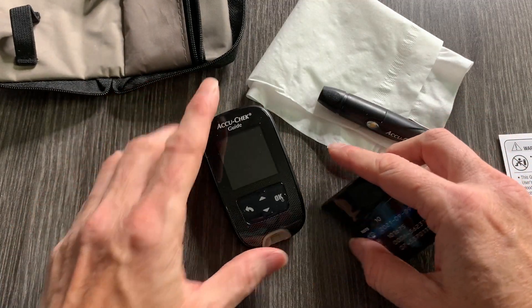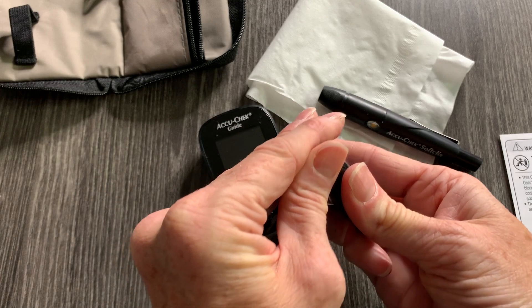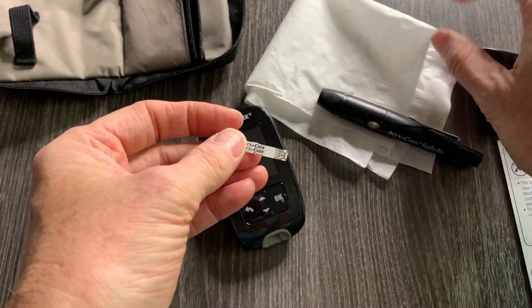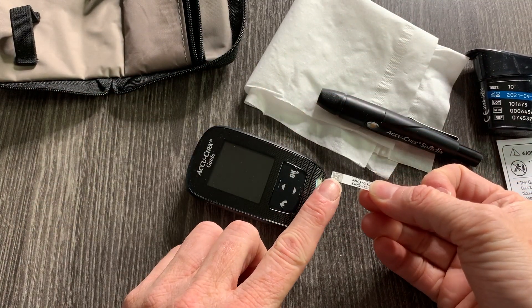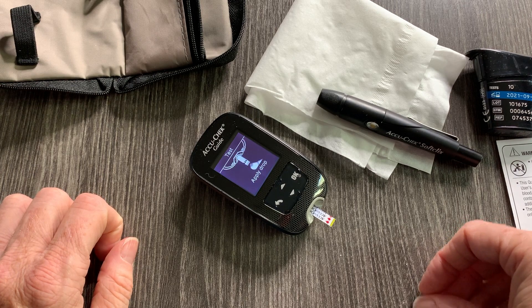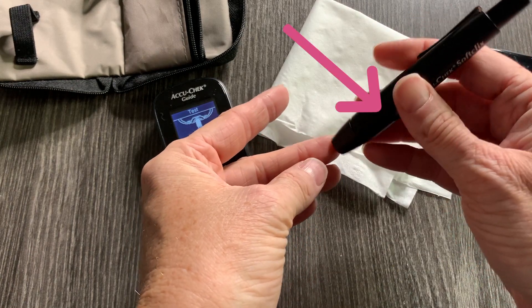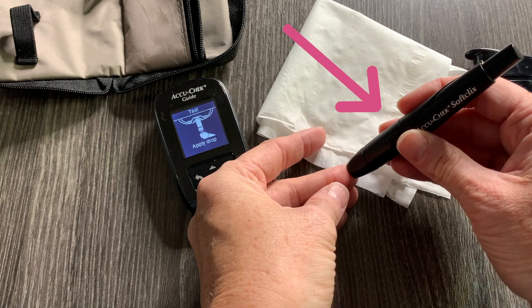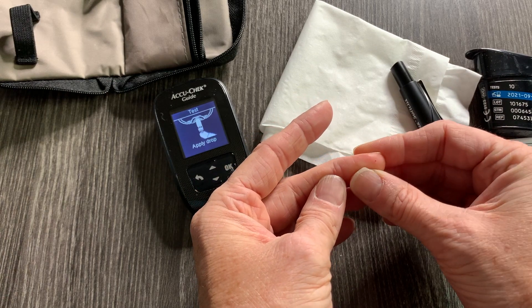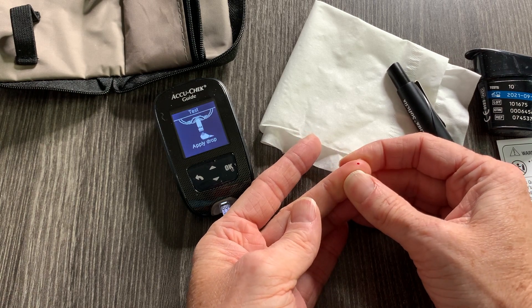Now that we've washed our hands, let's get the AccuCheck reader prepared. Take one of the testing strips and insert it into the machine — you'll see it come on and it's ready for blood. Select a finger on the side — avoid the center pad, go to the side. Press firmly but not too hard, then depress the ejector. Squeeze the finger, and you may need to milk it to get a reasonable-sized blood sample.